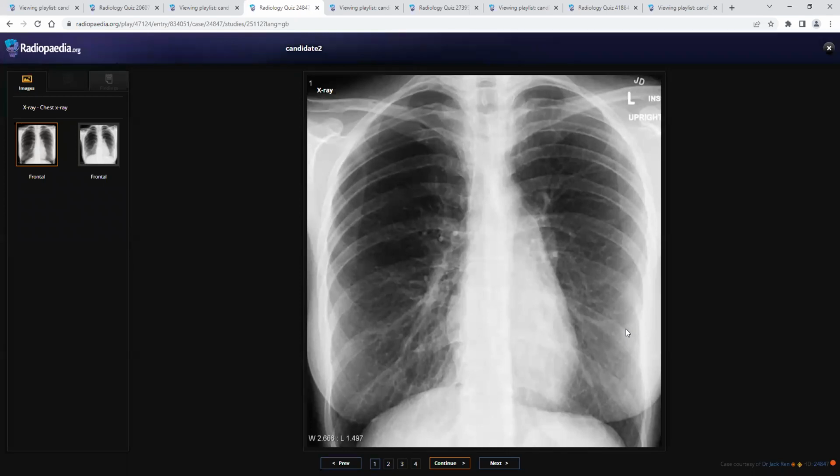Yeah, there was no history of trauma and it was very spontaneous chest pain. One question, the clinician wants to put a drain. What do you say? Chest drain. Okay, there is a pneumothorax, but he's asking you to put a chest drain. For me, no, I will not put the chest drain. It should be referred first to the interventional radiologist, maybe, or chest physician. You are the interventional radiologist. Okay.